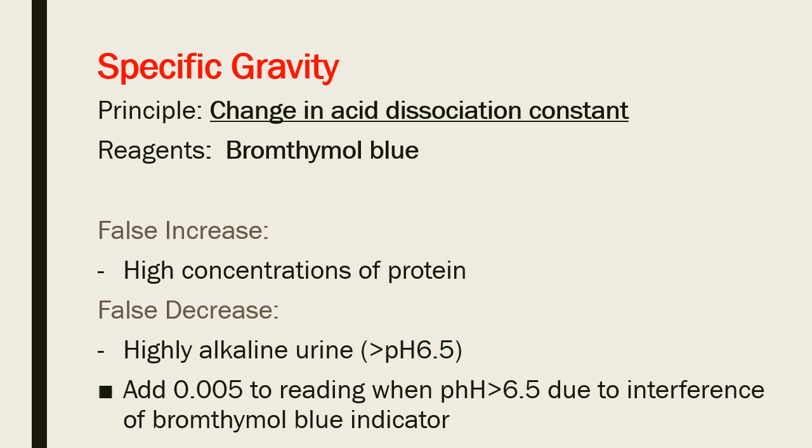Next, you have your specific gravity. The principle is a change in acid dissociation constant, the pKa change of your polyelectrolyte. The color indicator you have is your bromthymol blue.